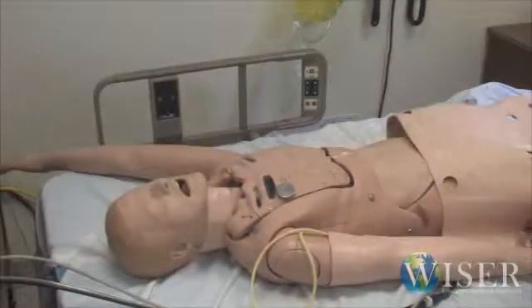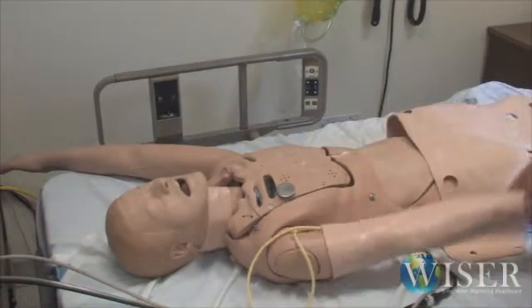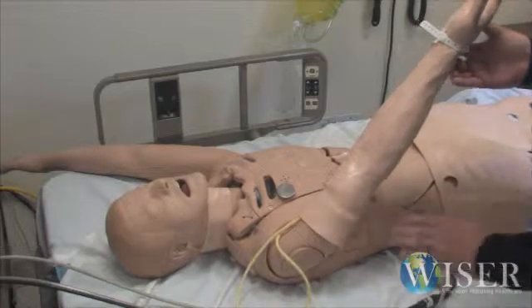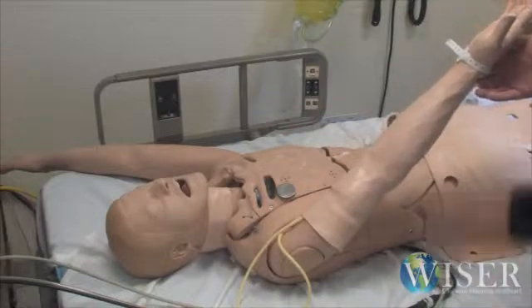Today we're going to go over troubleshooting pulses in your SimMan Classic. Now the first thing you want to check, and it might sound silly, but I'm going to say it anyways, just make sure he's connected. Generally, that's the first rule. Just make sure all your basic physical connections to your link box are in place.